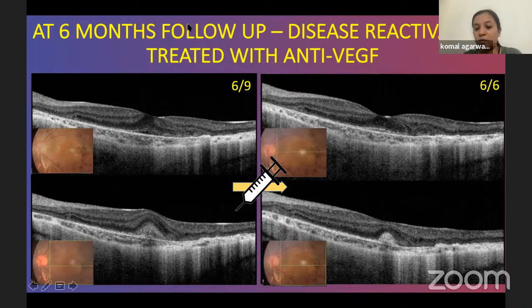Vishal, if you want to add something to that. Okay, just my viewpoint on that. I would err on the side of saying that when the TTT was done, maybe because it was not ICG guided or FFA guided, there was one small twig of that CNVM which had not properly closed, which cannot really be picked up on an OCT that much.